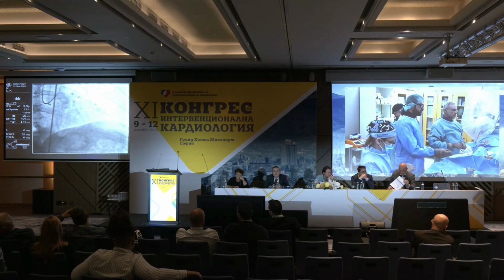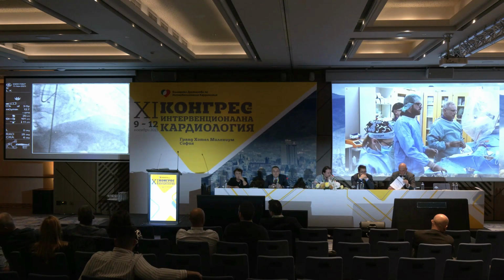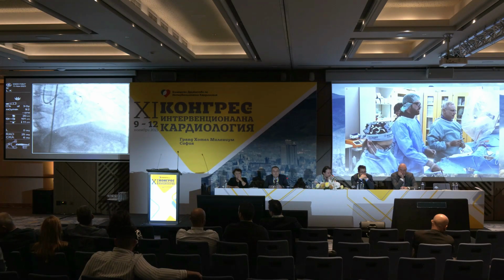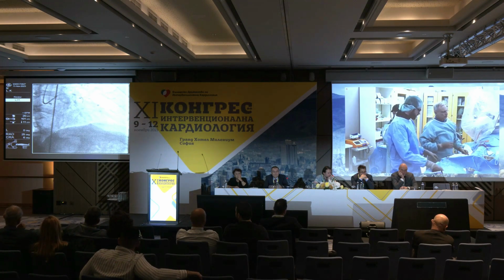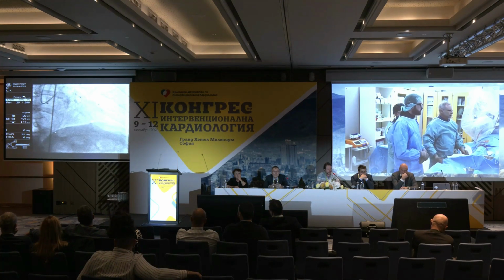So we can spend more time on the antegrade attempt, but because the occlusion is very short, I have the feeling that if by any means we achieve to go retrogradely fast and reliably and get access there, the ischemic time will be anyway quite short. So my appreciation about these things is not very much on the aspect of delaying too much. Fluoro store this. You saw that we had an easy crossing. We are already there, as you can appreciate.